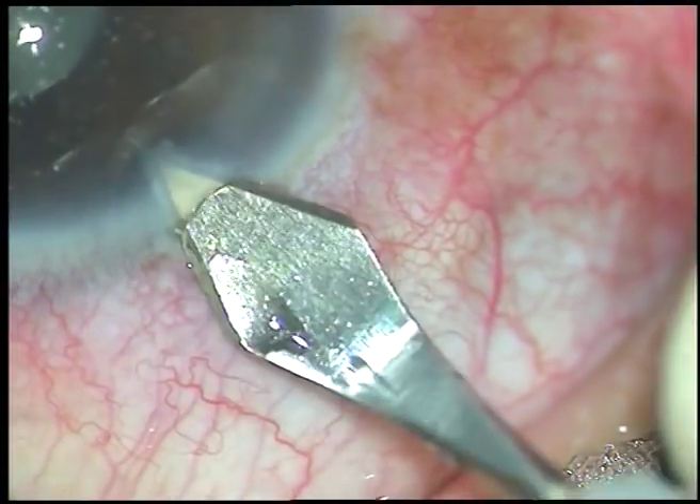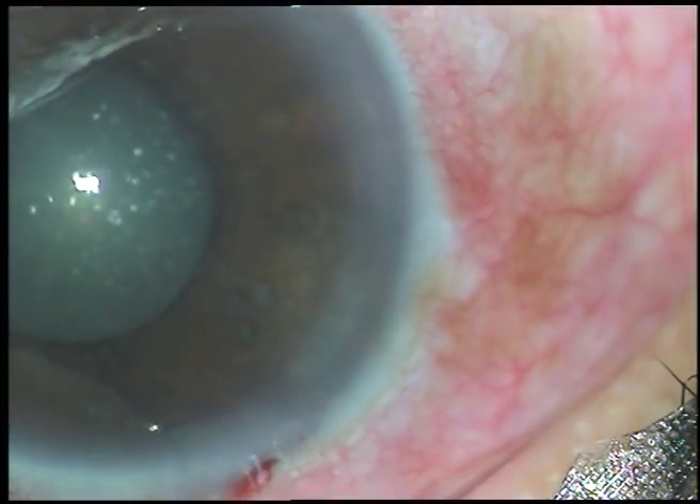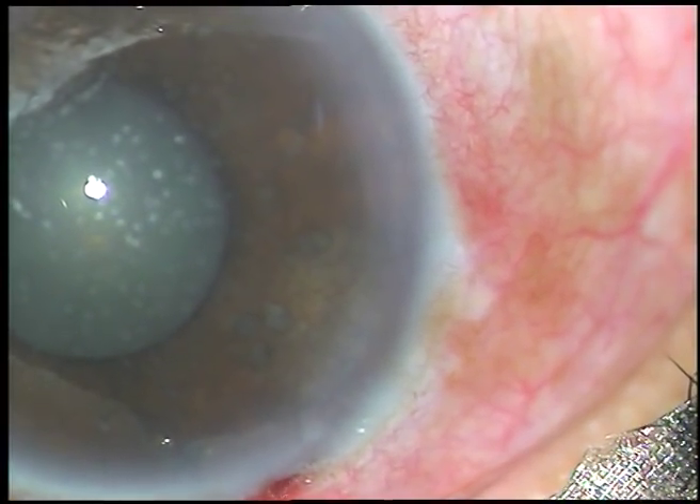This is a small paracentesis to reduce the pressure gradually — just depress the posterior leaf very gently. And now I inject an air bubble.